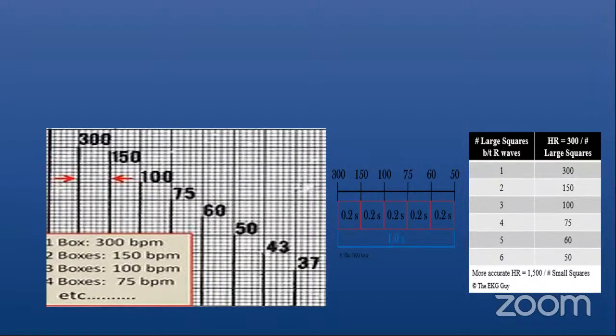Please, Dr. Yes, sir. In developing countries, most setups lack ECG machines, but they have monitors in their unit. They monitor babies without an ECG. So if a unit doesn't have ECG equipment and wants to check the rhythm or rate, is lead 2 from the monitor relatively equivalent or less equivalent? Can we use that for some information related to rate, rhythm, or anything?